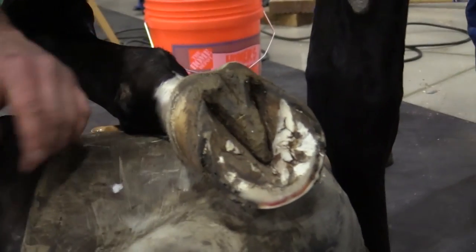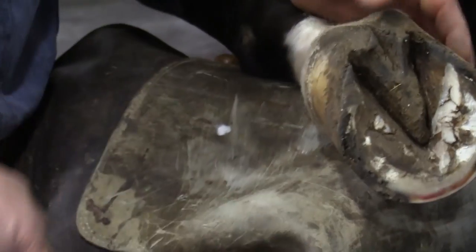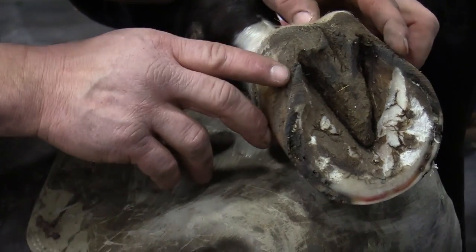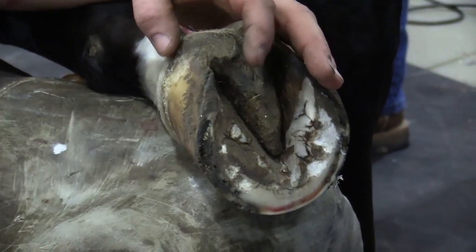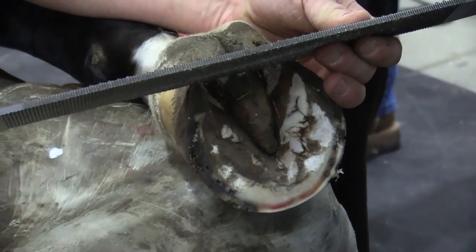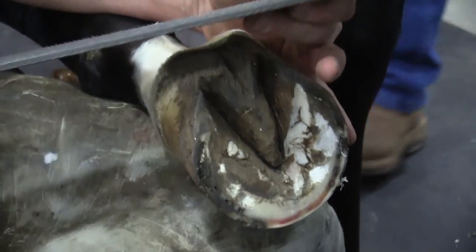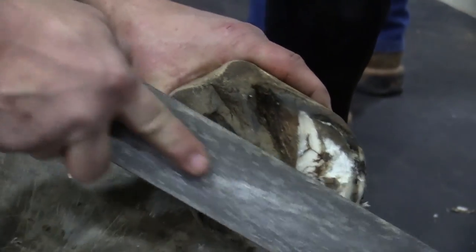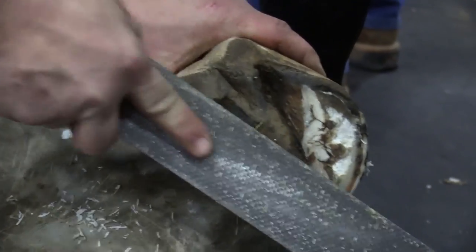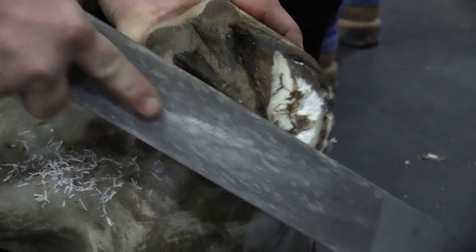Because of my big hiney or what, I can't trim this foot the same way I do the other one. I have to sit down here beside it, and I'm gonna take the opportunity to see what kind of heel we have. Where our load bearing surface stops right here, right now, I want to increase it by almost a full inch by bringing the shoe a little bit further back. So I'm trying to get more of that shoe and more of that heel loaded. I'm gonna put just a little slipper heel or rocker heel, whatever you want to call it.